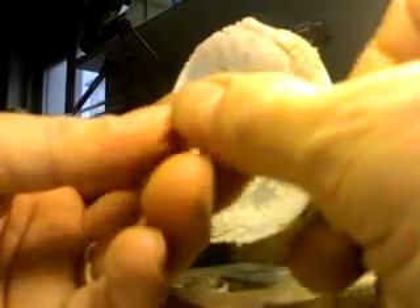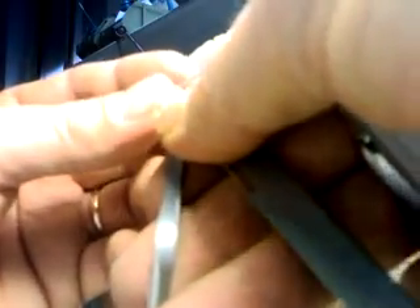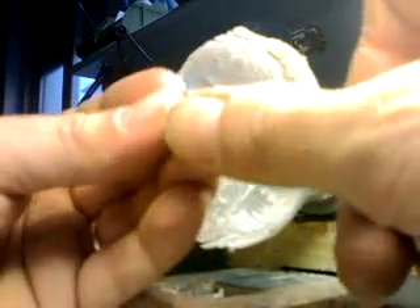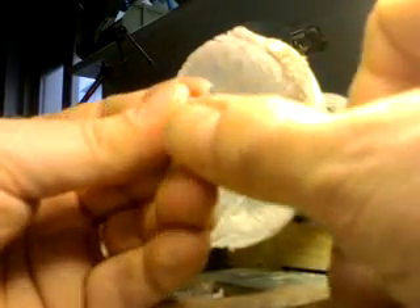Every once in a while I take my caliper and I keep measuring to keep track of how the thickness of the coping is doing. We're keeping a 0.304 thickness. I could pull it even thinner, but I have some extra space to fill up, so this will be just fine.